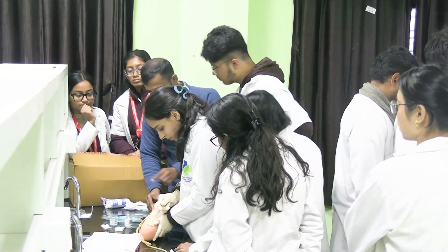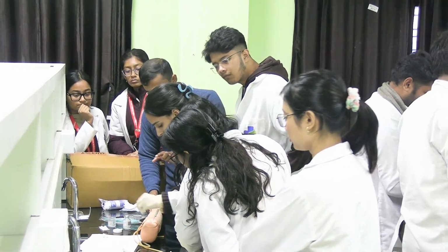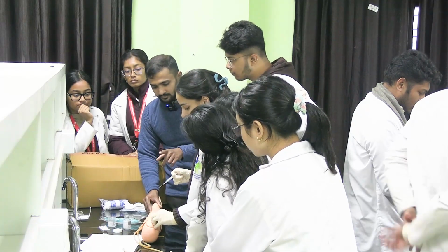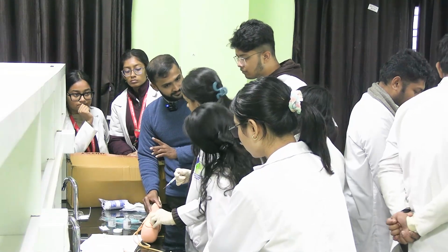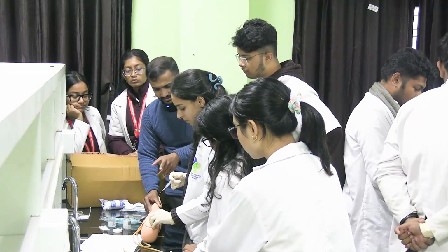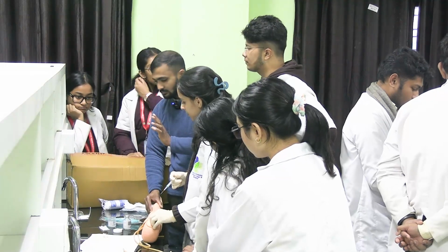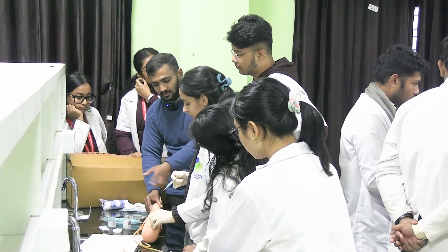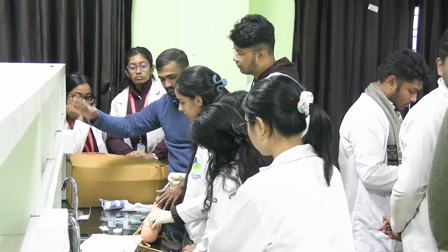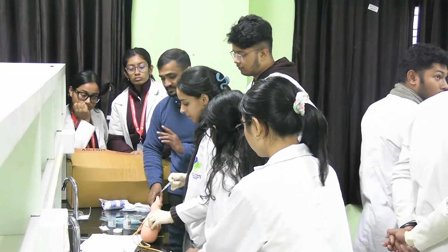Now take the swab and put it there. Remove the needle. Now you have to wait for 1 minute with gentle pressure with the swab. You have to discard this needle if there is proper disposal according to waste management. If not, then you can reseal it and keep it in an area where it should be disposed. So after 1 minute, what is the next?